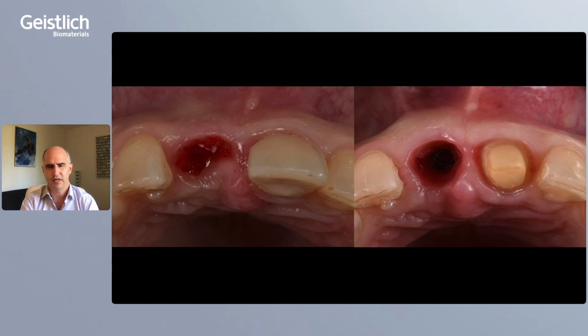Again, the point at the time of second stage and the situation at the final restoration. And this is just managed or achieved by a xenogenic collagen matrix. And I think this is a quite acceptable and good result in this context.